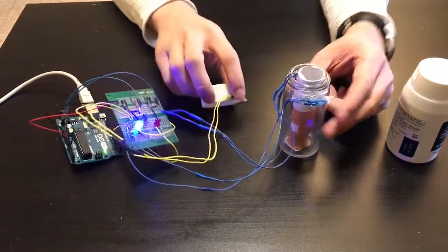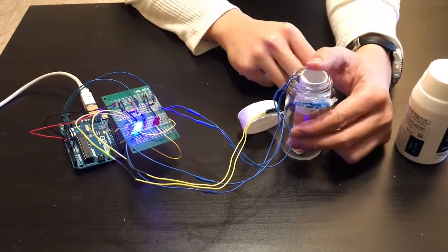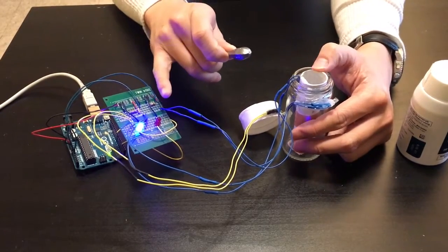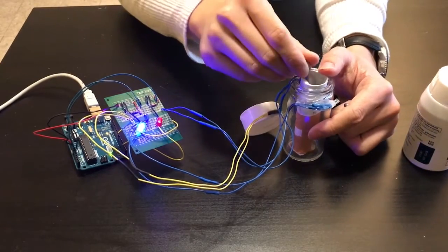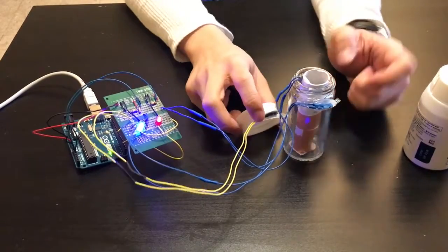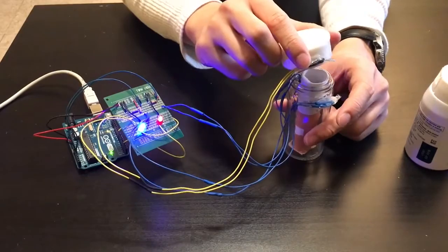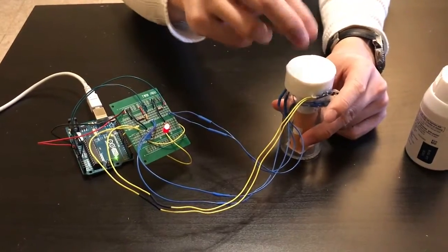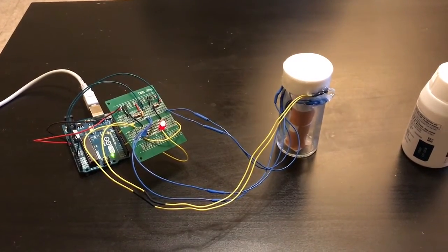We can also sense how many pills are in the pill bottle. This red LED here is connected to the pressure sensitive resistor and the brighter it is the more pills are in the pill bottle. This information is also sent via Arduino to our app that detects how many pills there are. So essentially we can detect if the patient has taken the pill and how many pills are left.